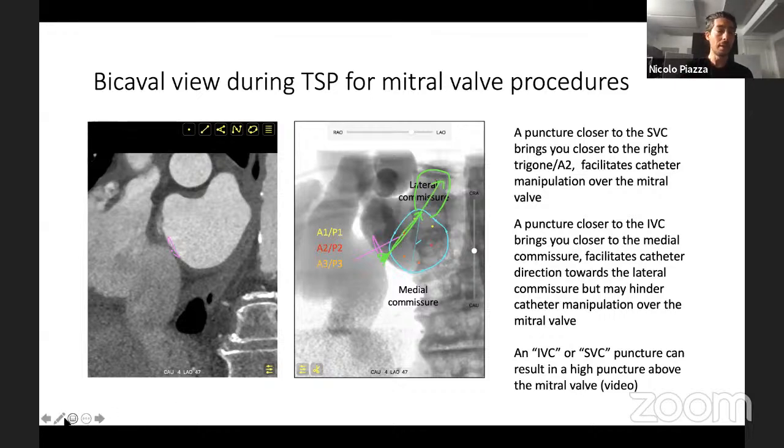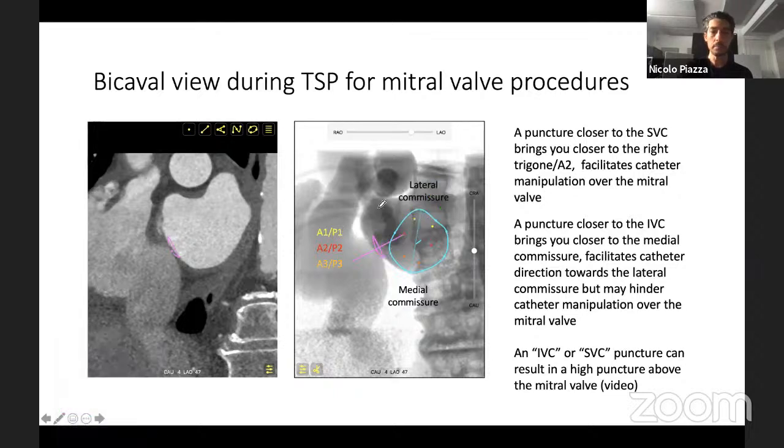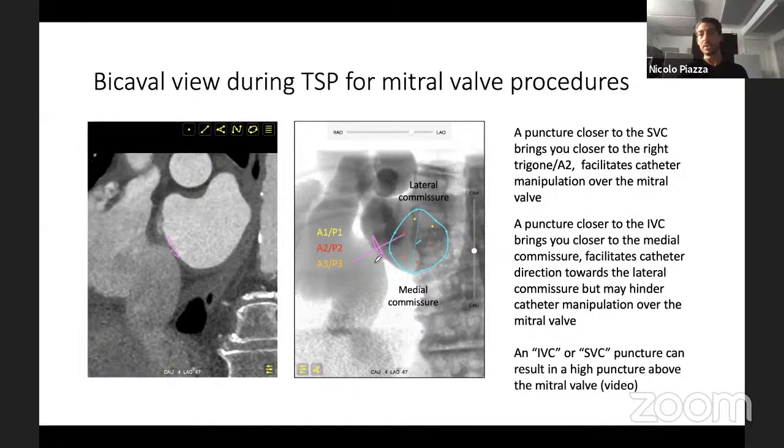Now, on the other hand, sometimes we talk about doing mitral clip procedures or some other mitral valve procedures. Okay, and we typically say go mid to superior so that you have somehow centralized yourself closer and that you'll be able to hover from commissure to commissure.